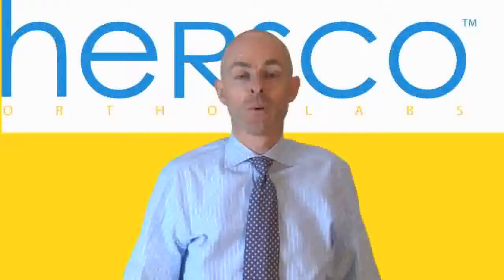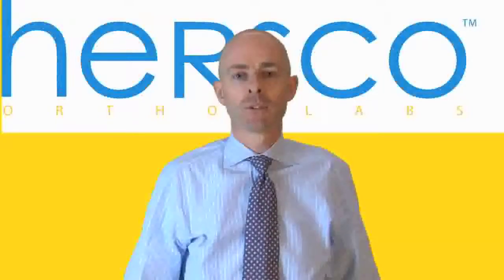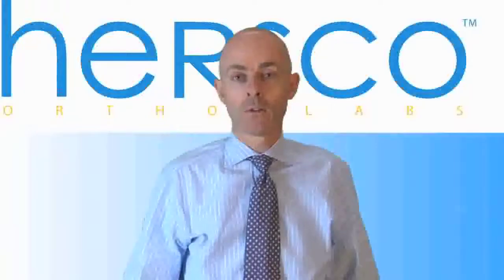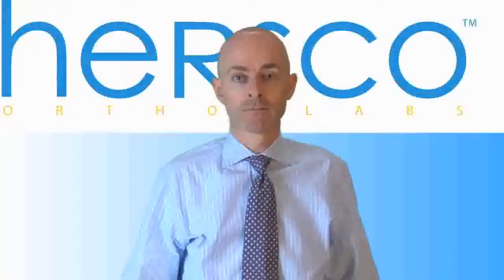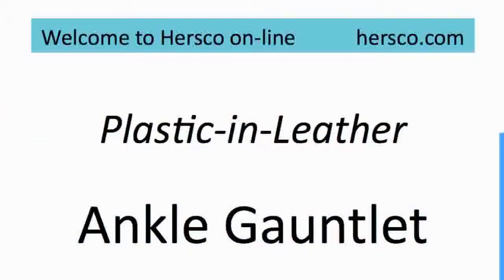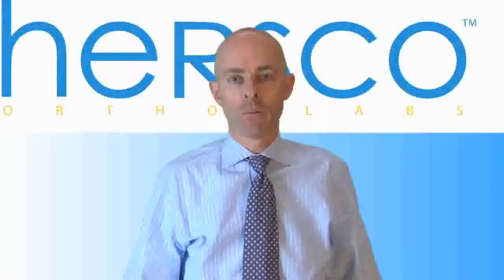Hello, welcome once again to Hersco Online, your virtual classroom for understanding tricks and tips in regards to custom foot orthotics, AFOs, ankle gauntlets, and Ritchie braces. In this portion, we're going to take a look at ankle gauntlets, the generic name being a plastic and leather ankle gauntlet, and they also go by the trade name of the Arizona brace.